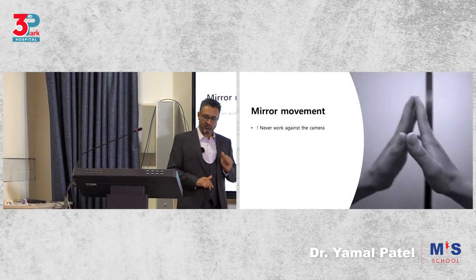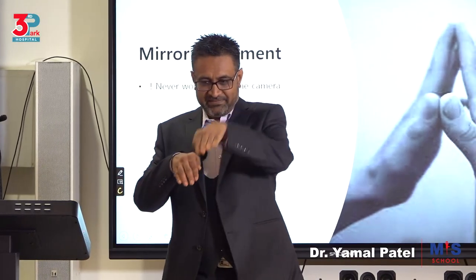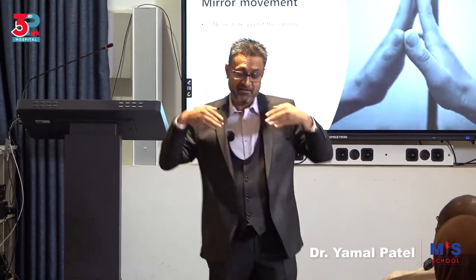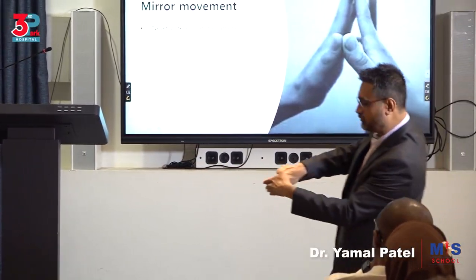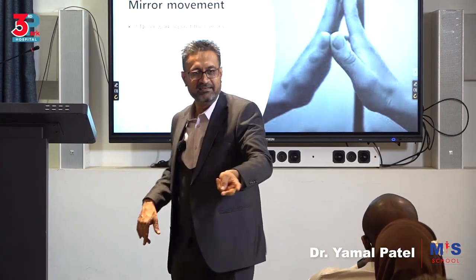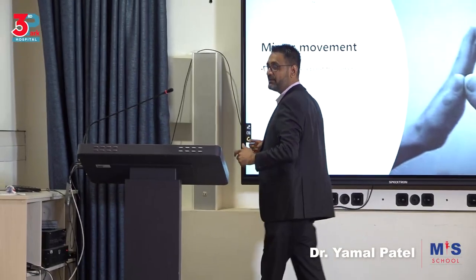Mirror image. Don't ever work against a camera. So if I'm seeing this way, I'm working this way, that's working along the camera. You've understood? If I'm seeing this way, and I come with a port with an instrument this way, it doesn't matter how good a surgeon I may be, I'll have a challenge trying to grasp because I'm moving against the mirror. So you'll have a problem when moving against the camera.